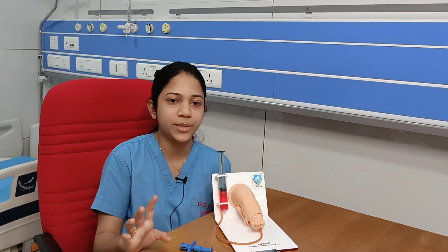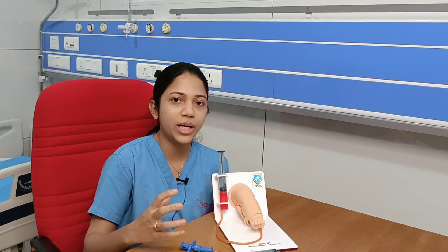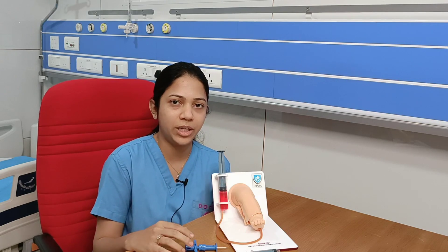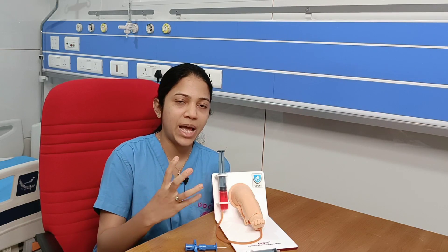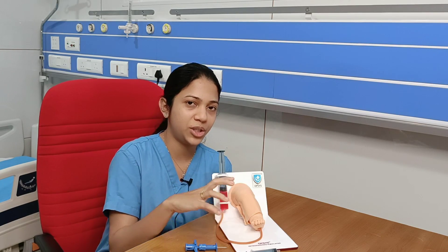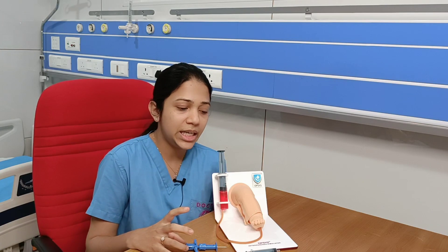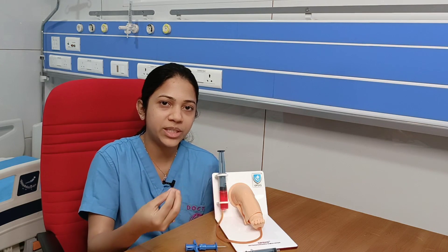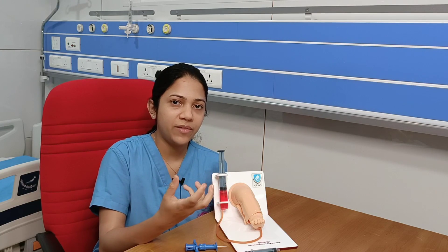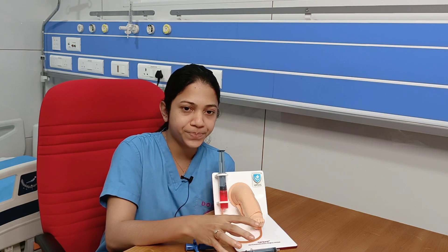Here I will demonstrate how to insert a bone marrow aspiration needle or IO access needle. All sterile precautions must be taken — gloves, gown, and full personal protective equipment. Equipment needed includes the IO needle, a syringe to aspirate and confirm placement by checking for bone marrow return, and local anesthetic if the patient is conscious and not in cardiac arrest.